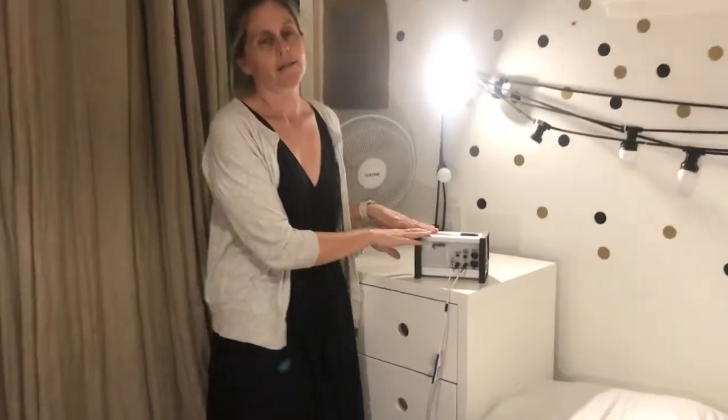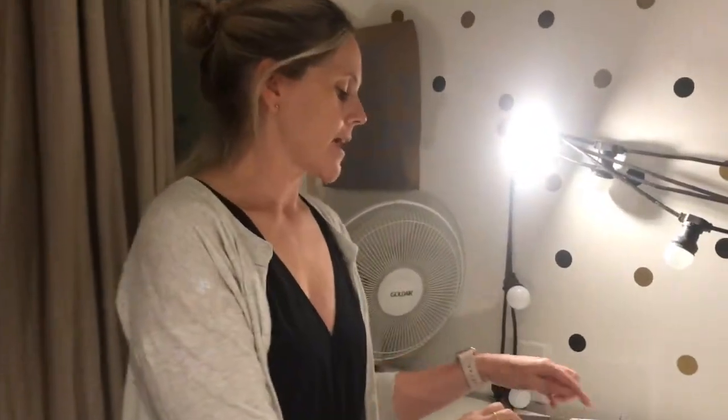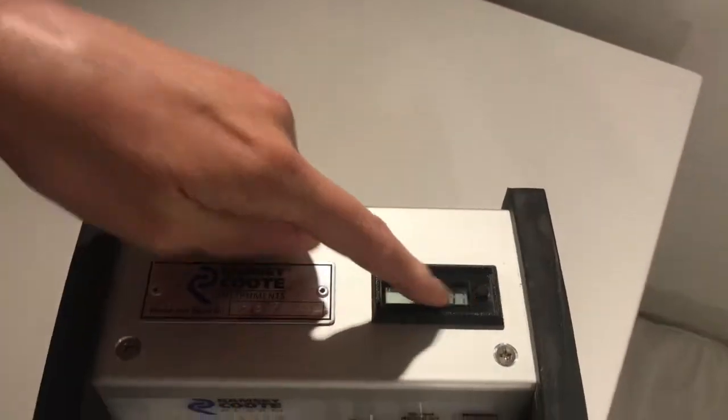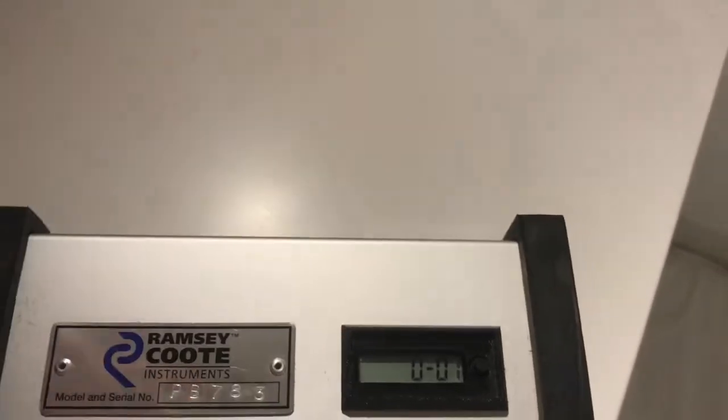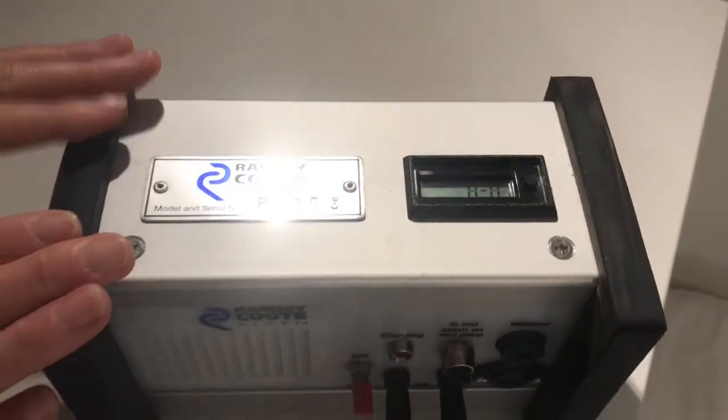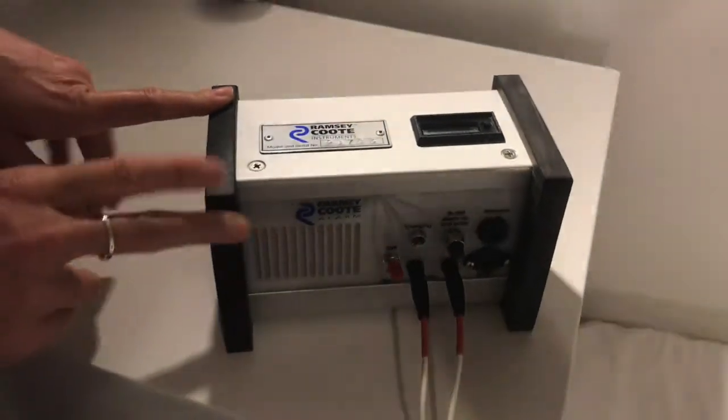One feature of this particular alarm, which is pretty cool, is that it has a little counter on the top to show how long it took. This one — can you see that? — seven seconds to turn the alarm off. And this can be really motivating for some kids who try and beat the clock.